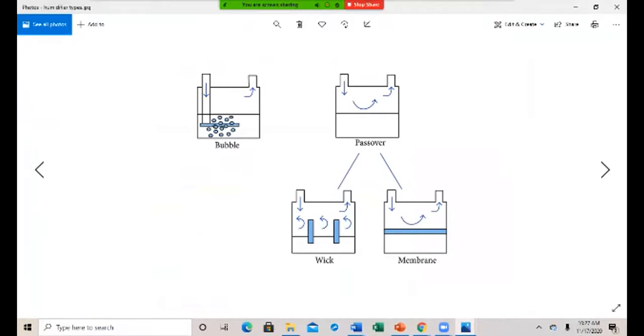Look, you've got the bubble humidifier, which is for your low flow device, right, of your nasal cannula. If you have it hooked up to the flow meter, the oxygen comes down to those little holes at the bottom of the bubble and they make bubbles right here. The longer those bubbles are touching water, the more humidity they build up. So the big one is better than the smaller one, right? Then the gas, those bubbles pick up humidification and come this way to the patient, right?